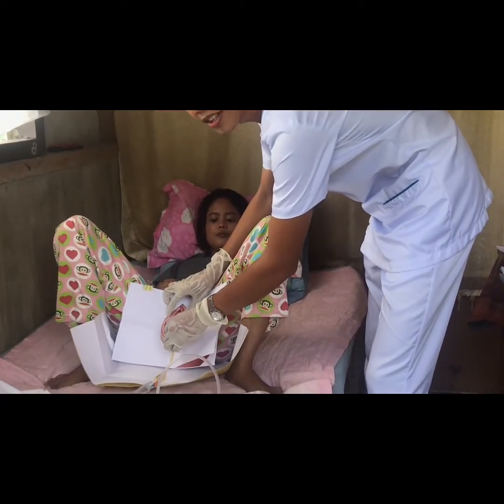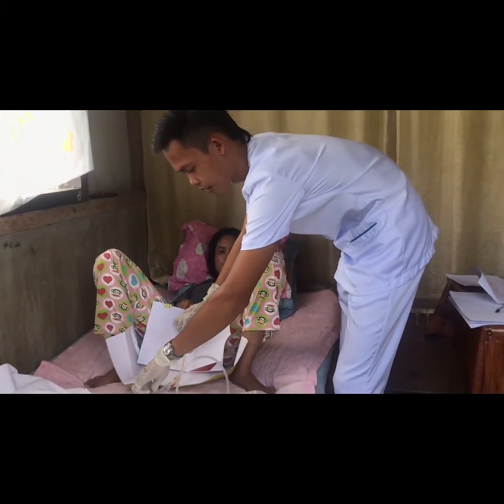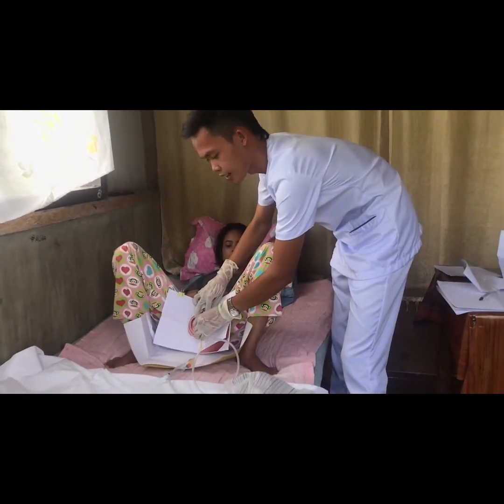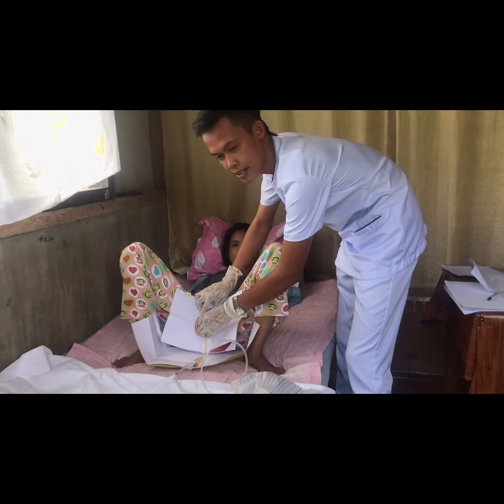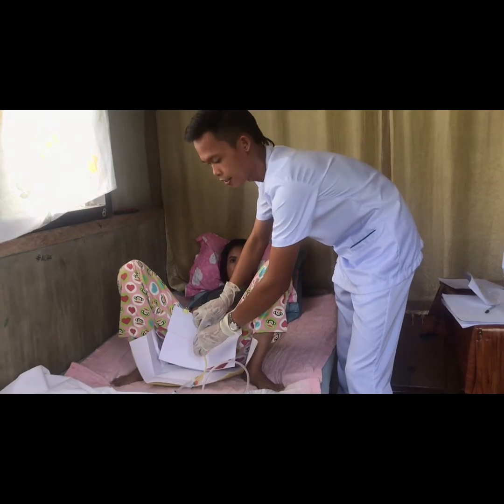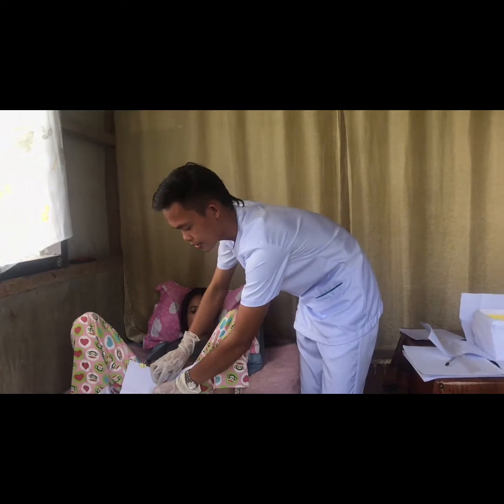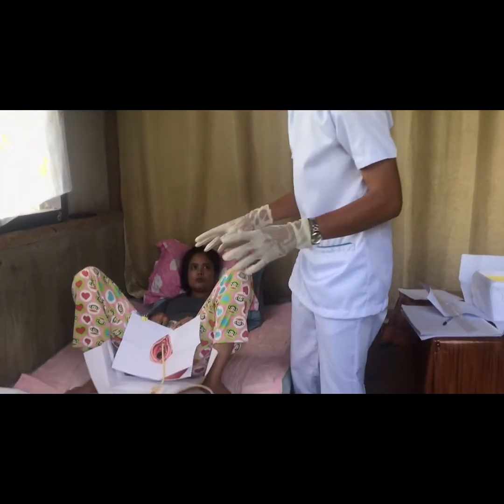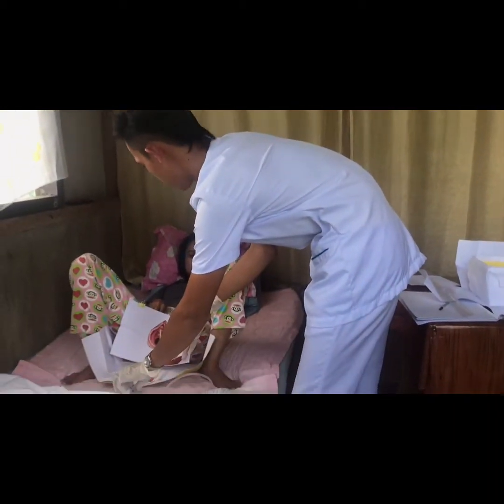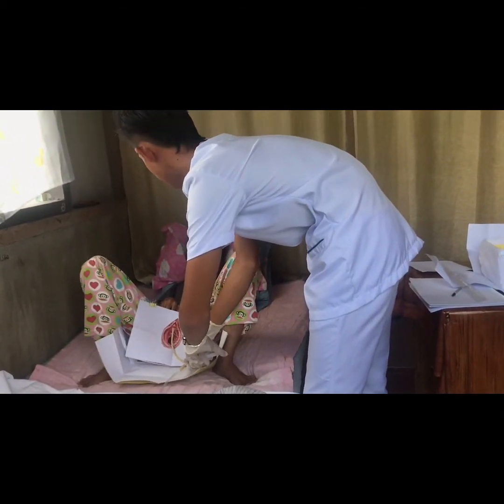Okay, so continue inserting until we see urine flowing into the catheter line or tube. Okay, I'm going to make sure that the catheter is intact. Okay, it is not moving, because if it is moving, it means that there is a possibility that it is not placed in a good position. Okay, after I make sure that the catheter is successfully inserted, I'm going to insert the distilled water gently. You okay, ma'am? Yes.